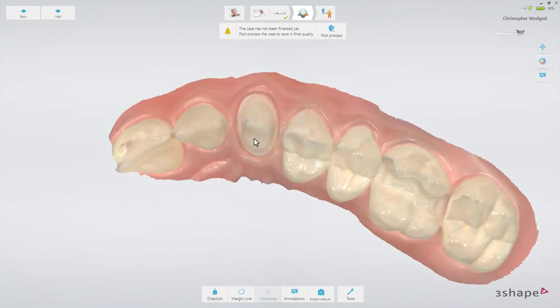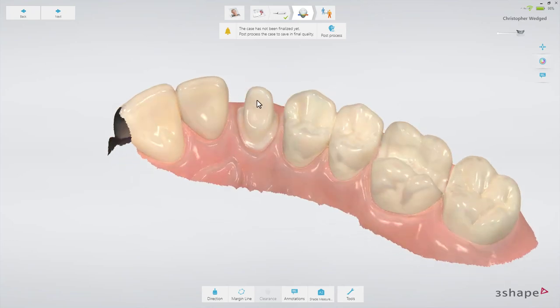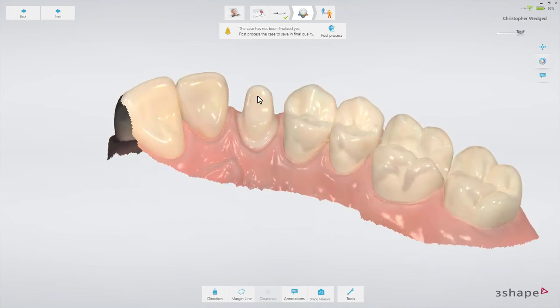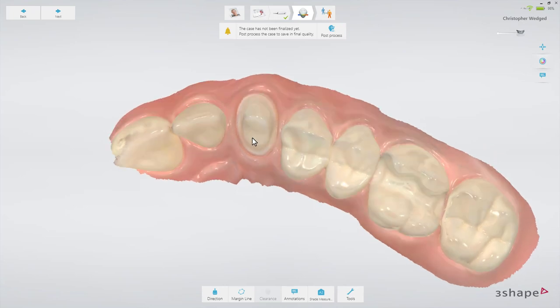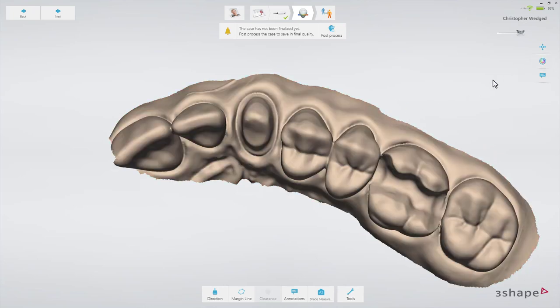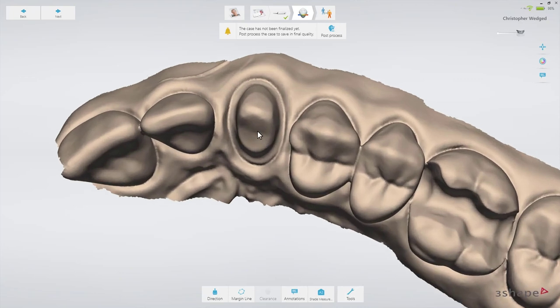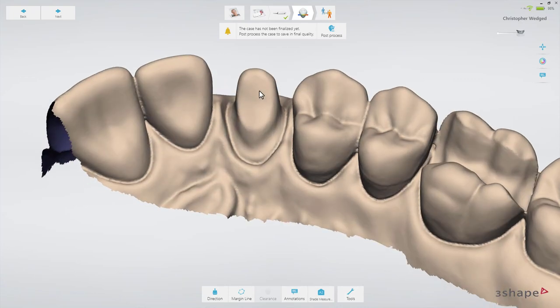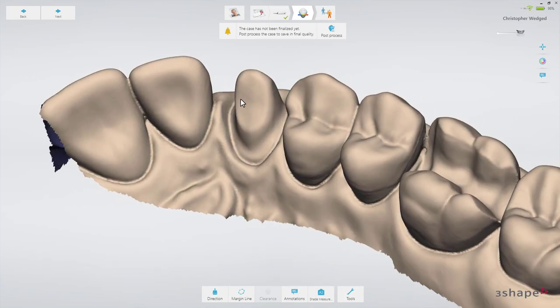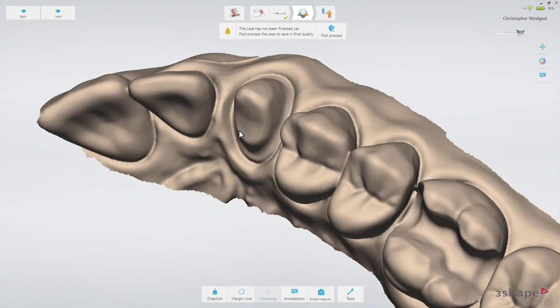Turning off the colors will in many cases make the 3D detail stand out more clearly. The scan shown on the screen is the preview from the scan page. By invoking the post-processing, you will bring out even more detail.